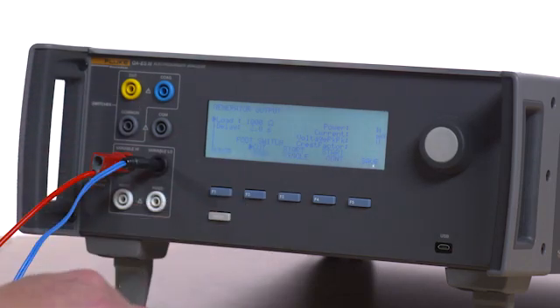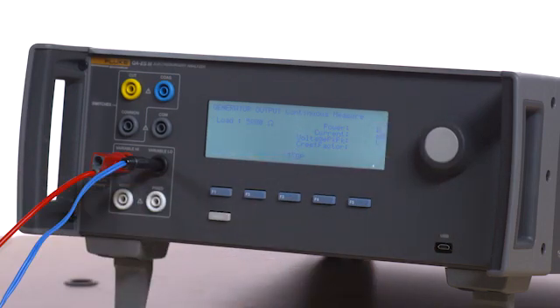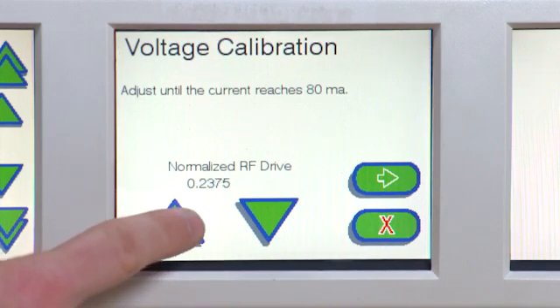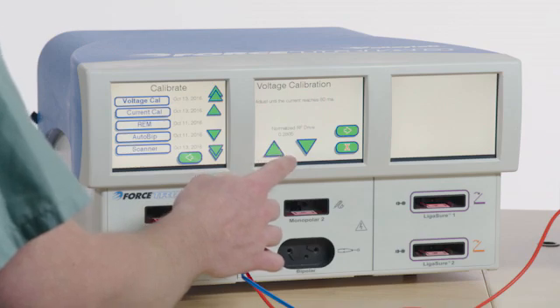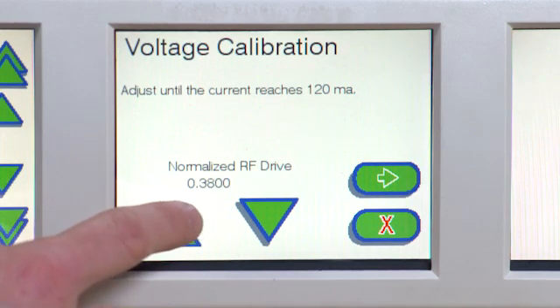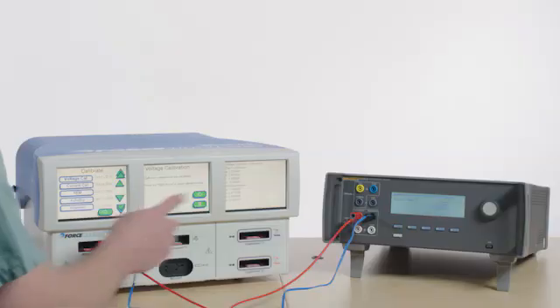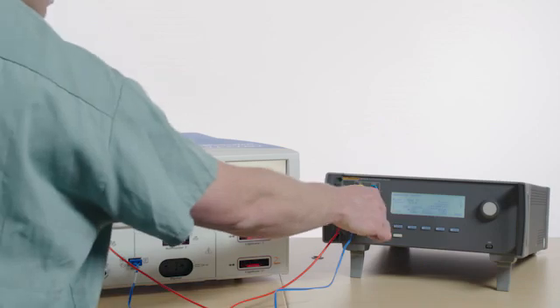Press F3 on the QAES-3 to stop the test. Select 5000 ohms and then press F4 on the QAES-3 for start continuous. Follow the on-screen instructions. Do not hold down the up or down arrows on the Force Triad — irreversible damage may occur to the system. After the on-screen calibration instructions have been completed, select the red X to exit. Press F3 on the QAES-3 to stop the test. Remove all test leads.